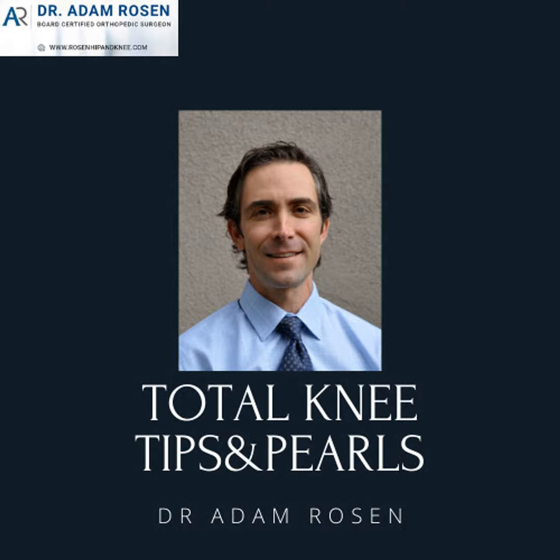And if there's a significant amount of bone loss that you're thinking, I don't even know if I can get a hinge in this person, this is when you want to back yourself up with a DFR and have those available. So it's really important to know the classifications.